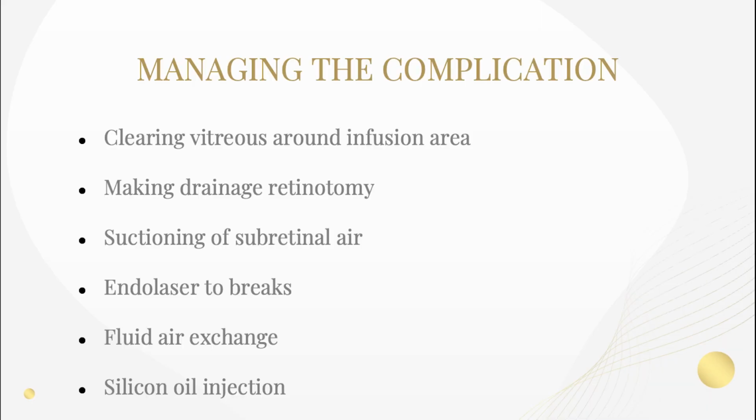This case was managed by clearing vitreous around the infusion area, making retinotomy and suctioning the subretinal air, followed by fluid air exchange, endolaser and silicone oil injection.